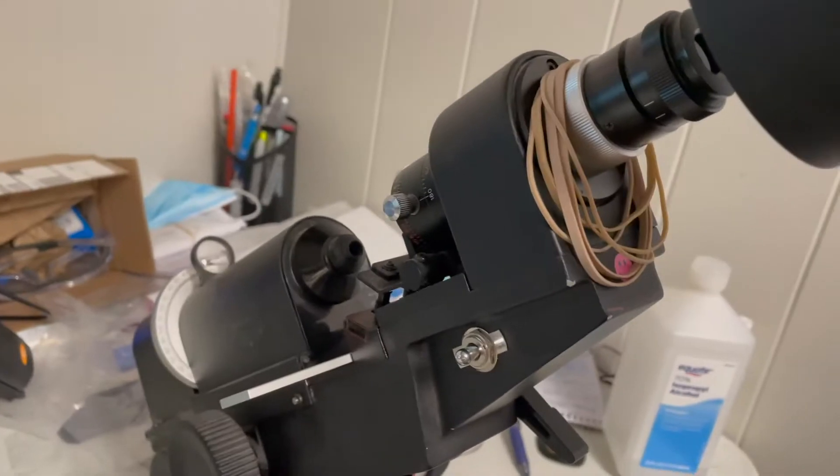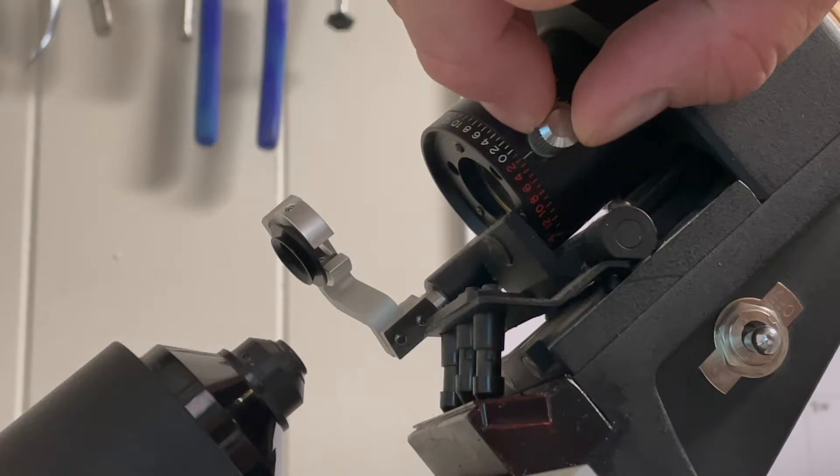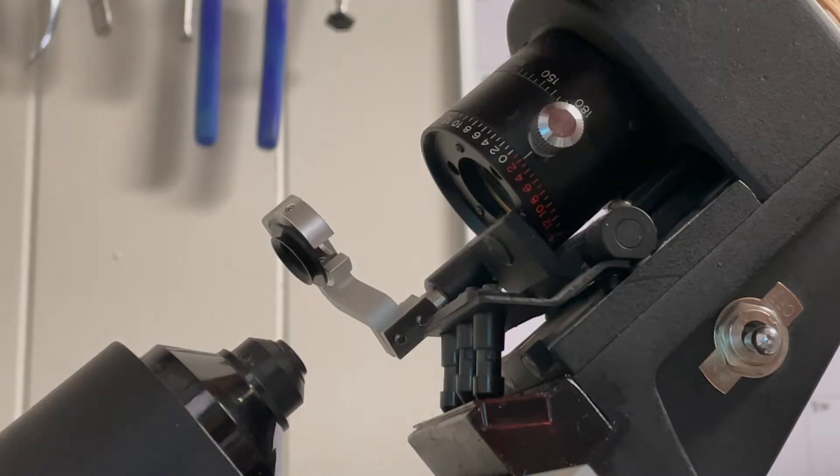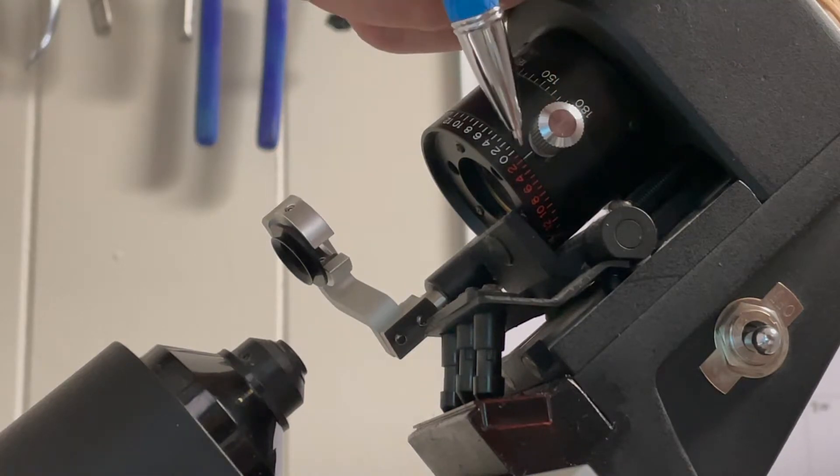In this series I'm going to show you everything there is to know: from how to set the eyepiece, the different parts of the lens meter, how to spot single vision lenses, bifocals, progressives, everything in between, and all the common mistakes to avoid.